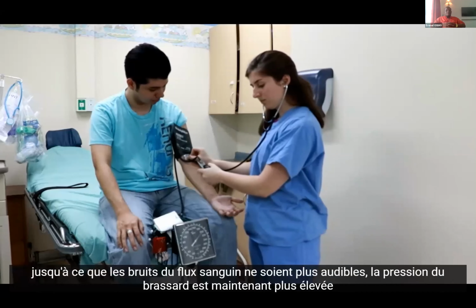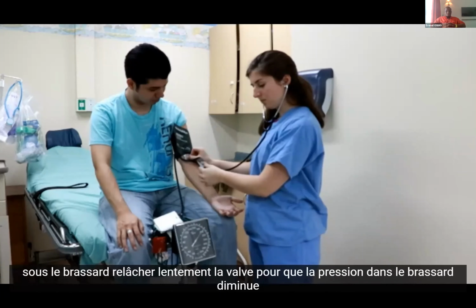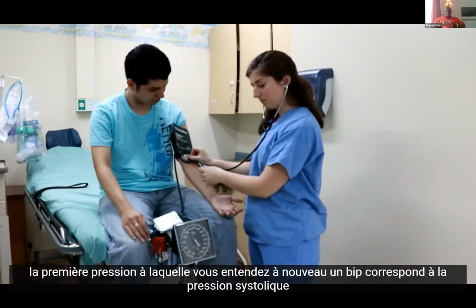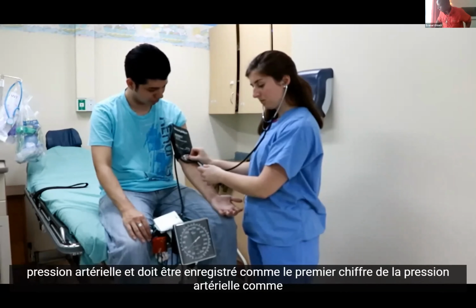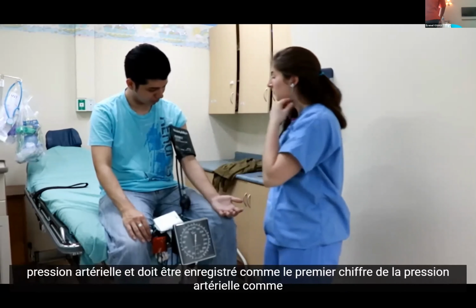Cuff pressure is now higher than the patient's peak blood pressure and no blood is flowing in the vessels under the cuff. Slowly release the valve so that pressure in the cuff decreases. The first pressure at which you hear a beat again corresponds to the systolic pressure and should be recorded as the first number in the blood pressure.